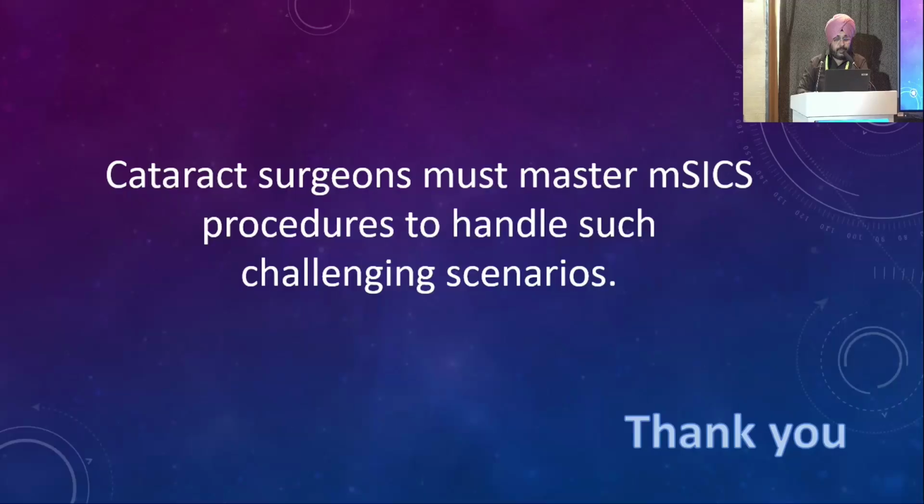So one should master manual small incision cataract surgery to handle challenging situations. This is the one situation. Otherwise, with a good sclerocorneal tunnel, good incision, good capsular access, and good control of the instruments, you can overcome all the difficult situations that we routinely encounter in difficult cases.